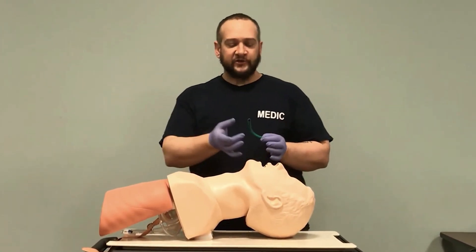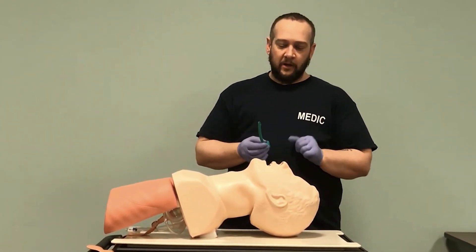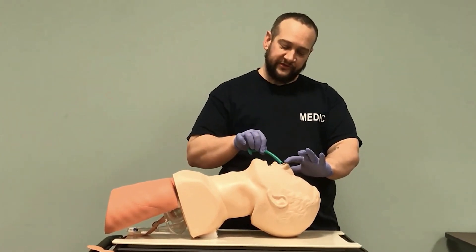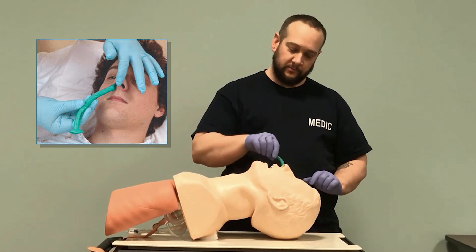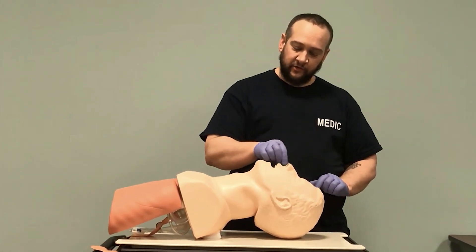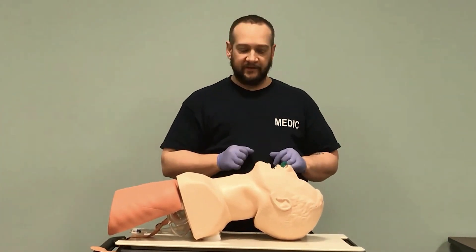So you want to make sure that you lubricate this, then piggy up the nose. The bevel goes towards the septal wall and it comes in at a twisty-turny method. What we have here is this little trumpet — that's the flange — and it sits nicely against the nose.